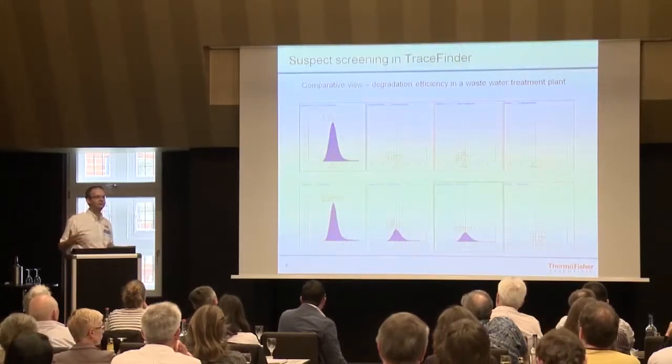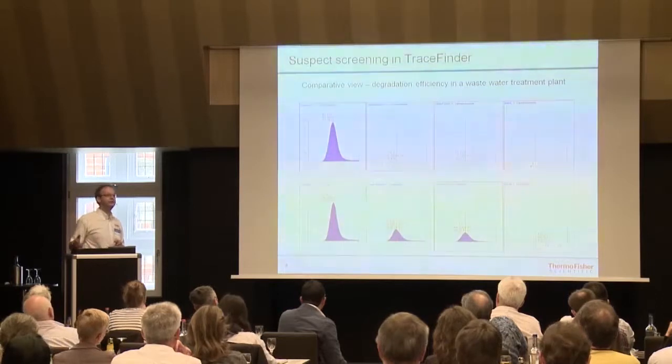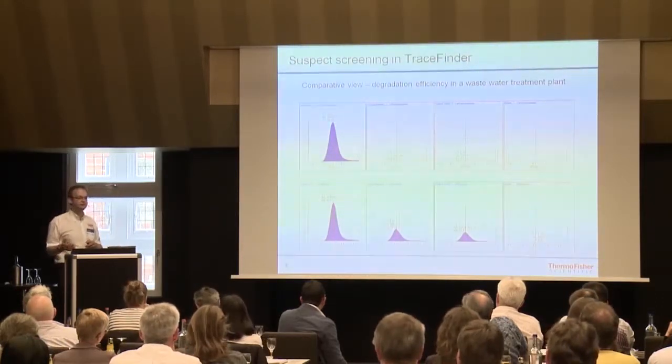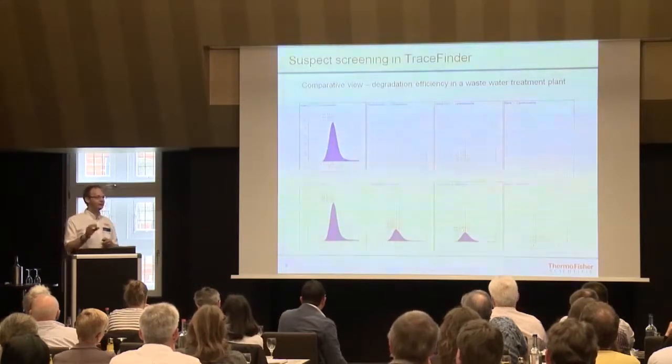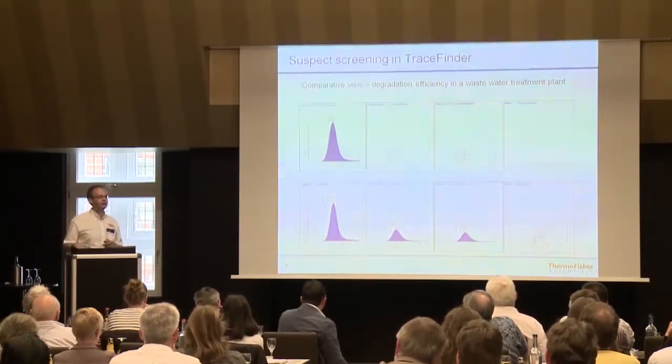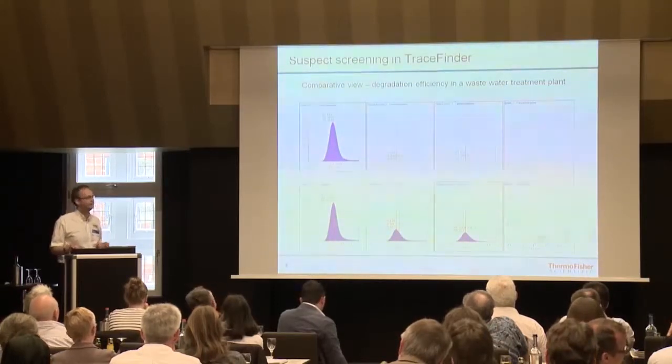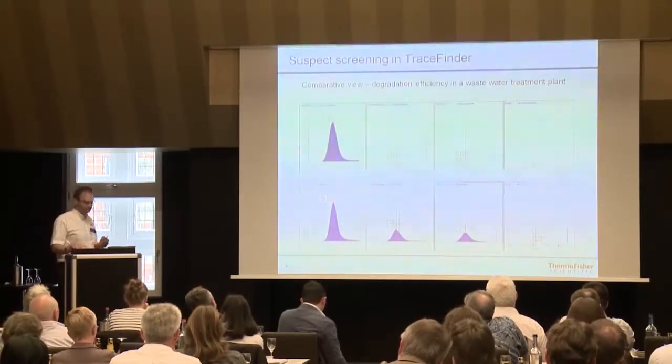So this is sort of a semi-quantitative approach where you even don't need any Cal standards. You just can run it with your full scan data. Still, this is just one measurement for each sample, which I show here, on a generic method. So it's easily done. The whole analysis was done in 1 hour, and you can draw lots of data out of it.